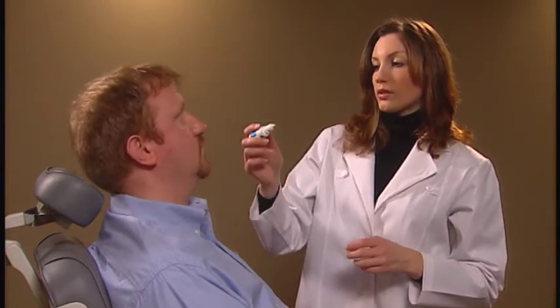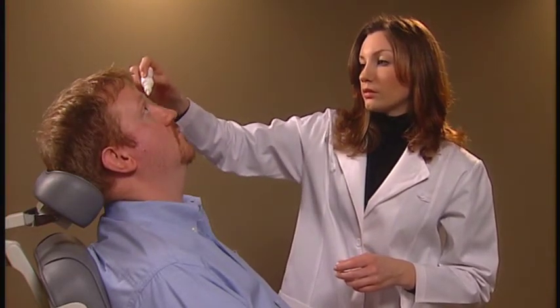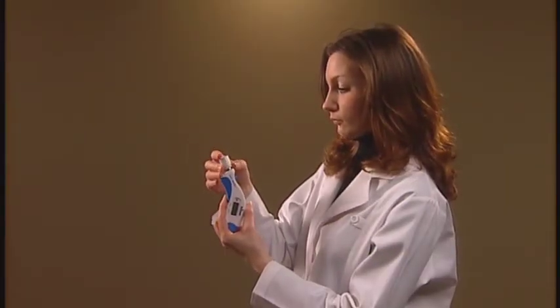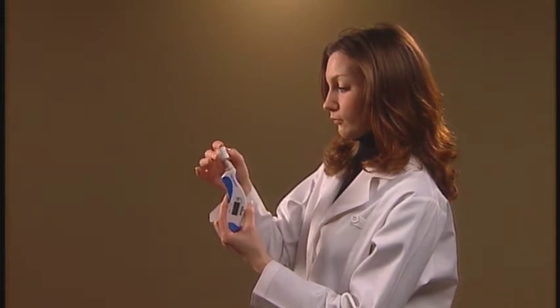The first step is to anesthetize the patient's cornea by the application of a topical anesthetic. The next step is to prepare the Tonopena Via Tonometer for use by placing an Occufilm tip cover on the transducer.